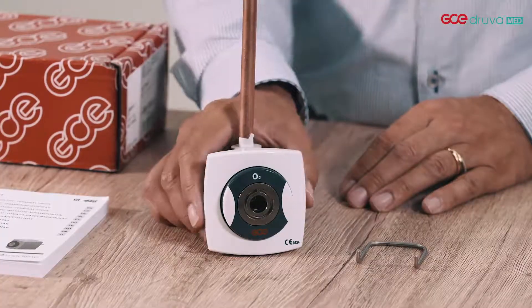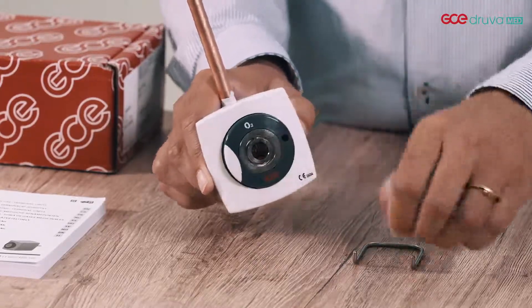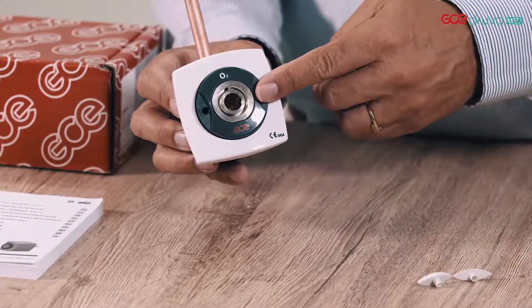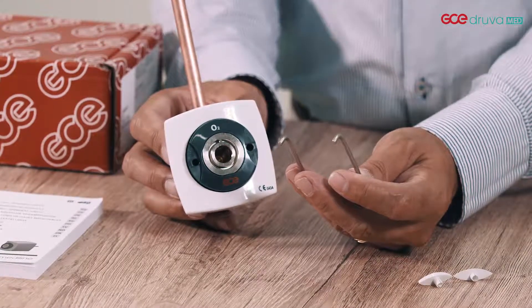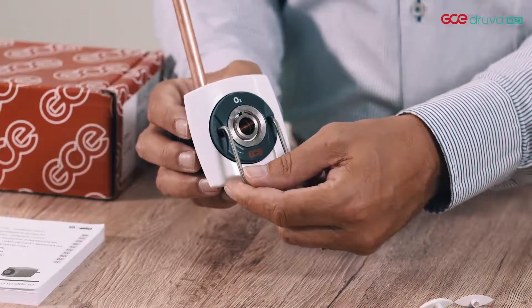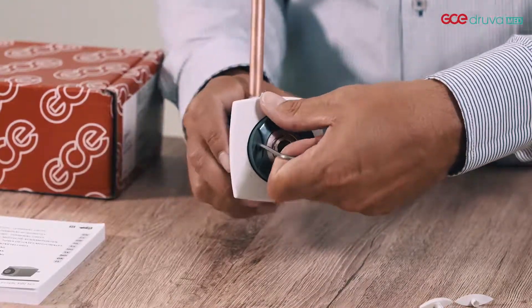Now I will show you how to disassemble the unit in case of repair or maintenance. First, remove the gas specific buttons. To remove the button you need a special tool, which even prevents patients or children from removing the button by hand. You will need the tool — put it into the two holes and pull.